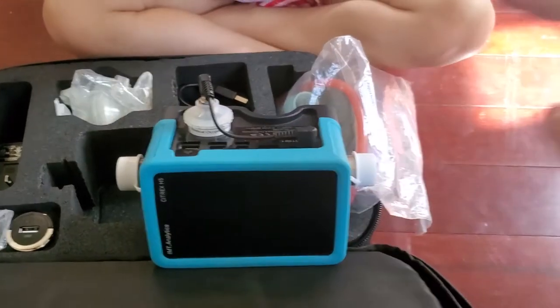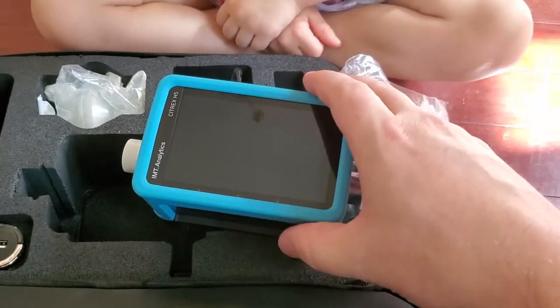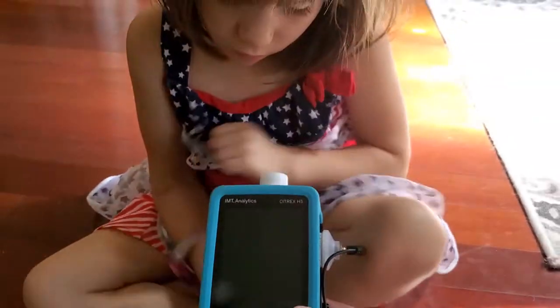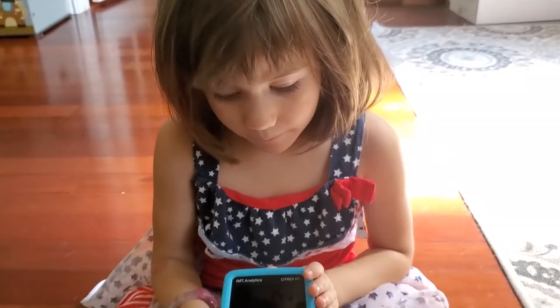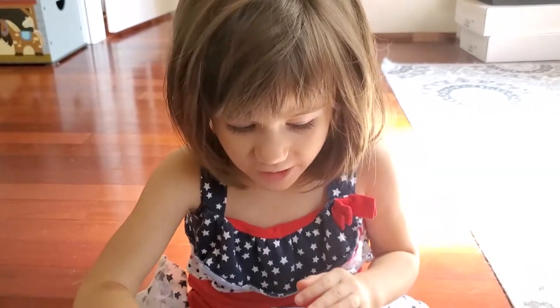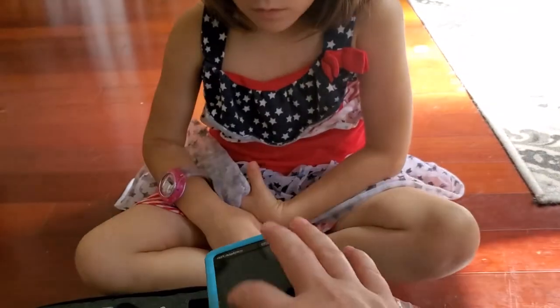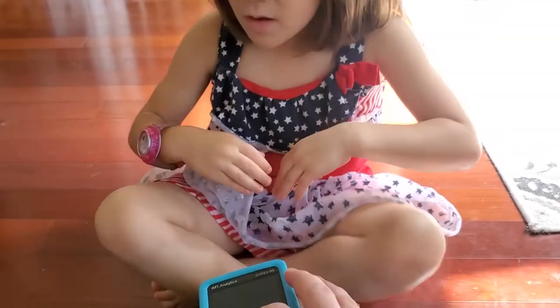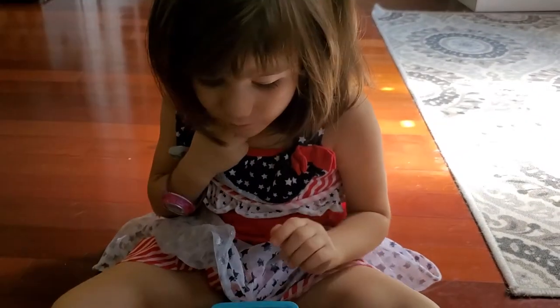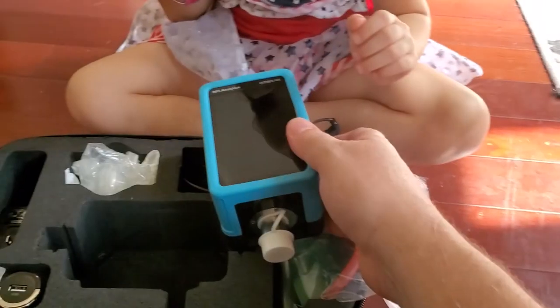This guy does all that, but it graphs everything out and it's very pretty. That is the IMT Analytics Citrex H5 — pretty cool! It looks like a tablet — that's because it is a touchscreen and it is like a miniature tablet. How crazy is that? It's like a little computer! All right guys, that's all I've got on this one. Thank you IMT Analytics, thank you so much for sending this over.